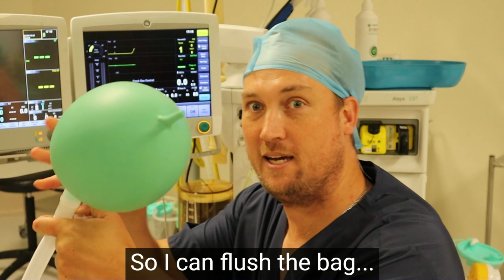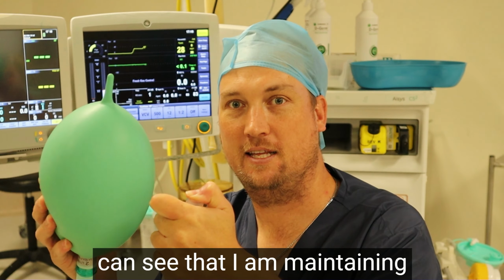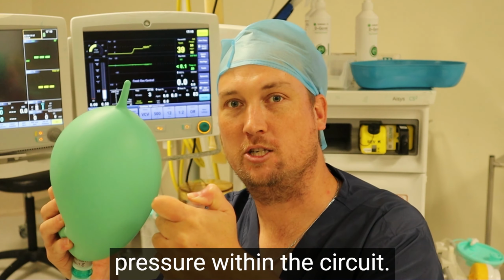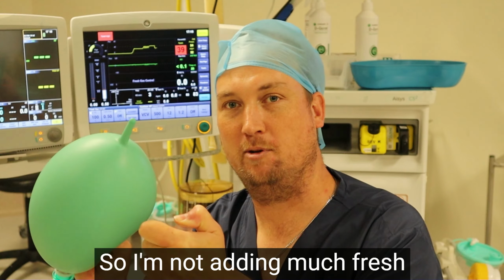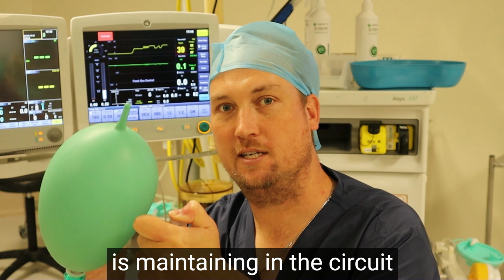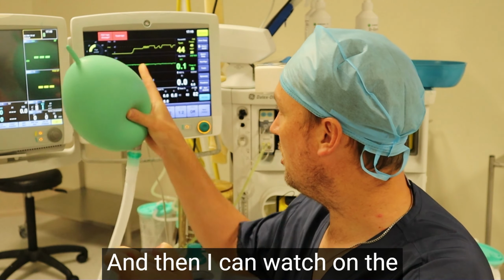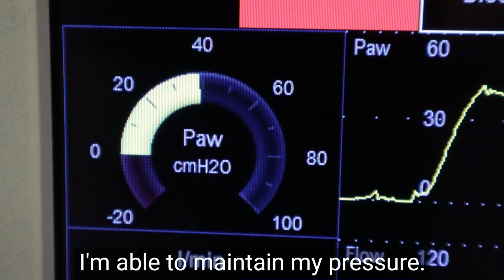So I can flush, the bag fills, I'm occluding the end, and I can see that I am maintaining pressure within the circuit. So I'm not adding much fresh gas flow, the pressure is maintaining in the circuit, and the bag is not emptying. And then I can watch on the ventilator graphics as well that I'm able to maintain my pressure.